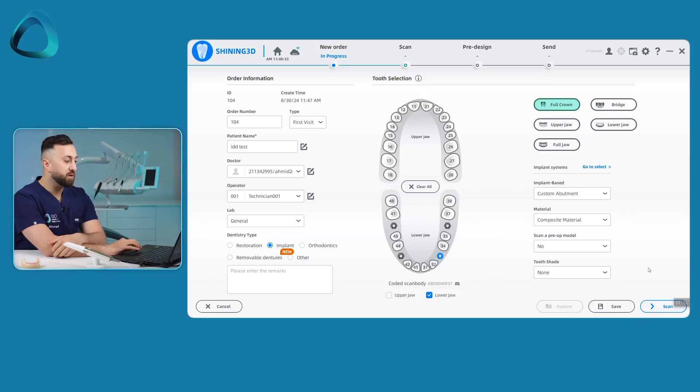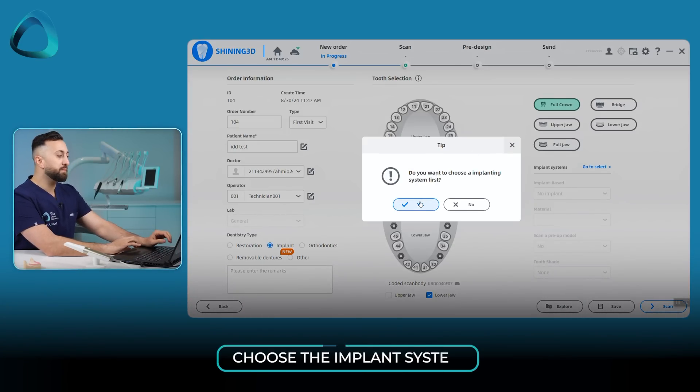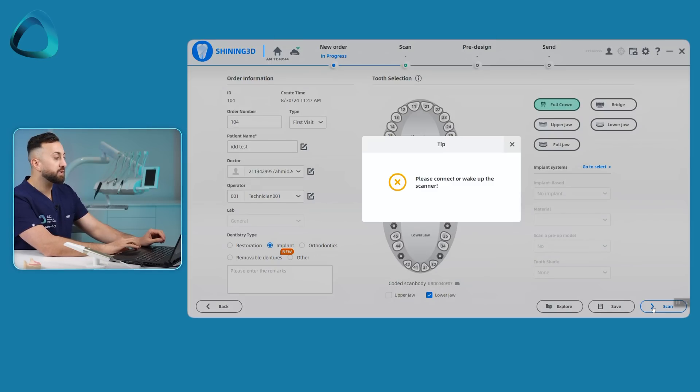There are a few other options where you can scan a pre-op model — that's the case where you have a prosthetic already made — however, we're not going to do that in this video. Instead, we're going to assume these are immediate loading: we've just placed the implants and put the multi-unit abutments. Take note, the system works on multi-unit abutments; it is not direct-to-fixture. Then we click scan, and it asks if you want to choose an implant system first. I would just pick OSTEEM and add it to all applications. If there are multiple different implants, you can choose different implant systems — the software is actually quite intelligent and well thought out.